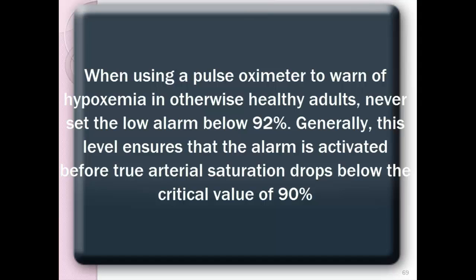Now, I know a lot of patients that, especially if they're having to wear these things at night, and every time they turn over, this thing goes off and wakes them up, so they'll go in and turn this down real low, or turn the alarm off so that it doesn't disturb the patient. But in reality, if a problem arises, by the time you're called in there, then you have a very sick patient. You have a very critical situation. Whereas if it calls you in there at 92, you still got a little time to get on top of things and the patient doesn't get in distress.